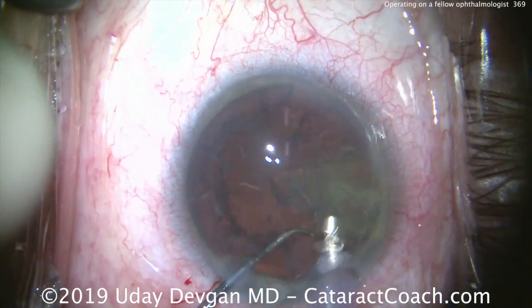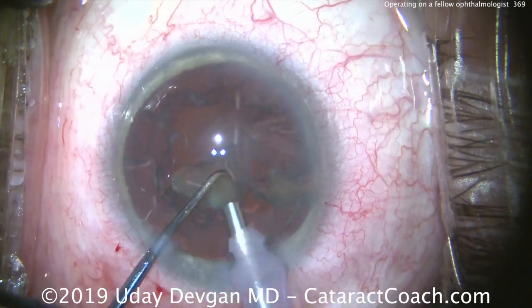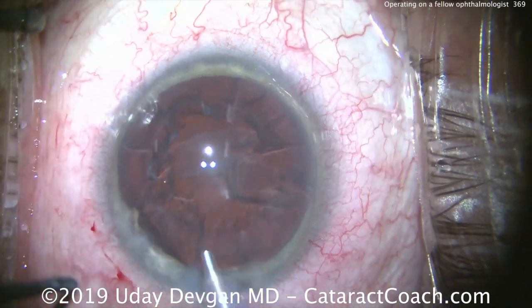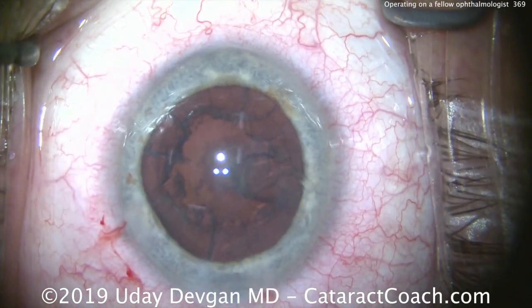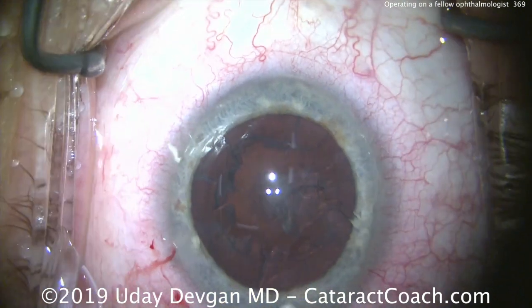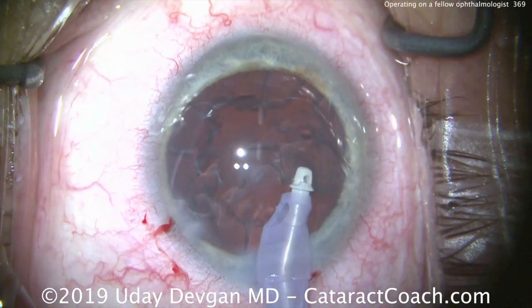And so we'll take out our cataract pieces here, finishing this up nicely. And look at the chopper position. That's protecting the posterior capsule just in case. Take the instrument side of the eye and we'll clean up here. The surgeon here wanted just a monofocal lens aiming for, I believe, a little bit of myopia, which I'm very happy for me to be myopic now because of presbyopia.